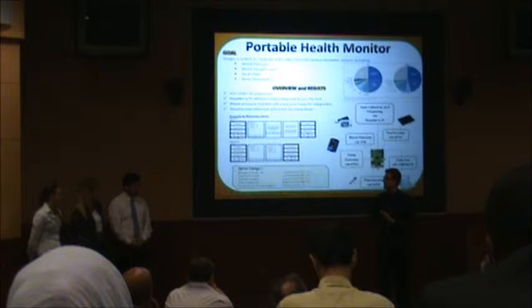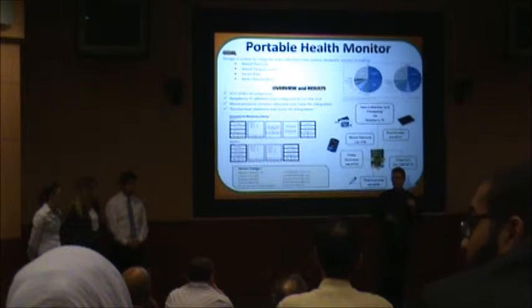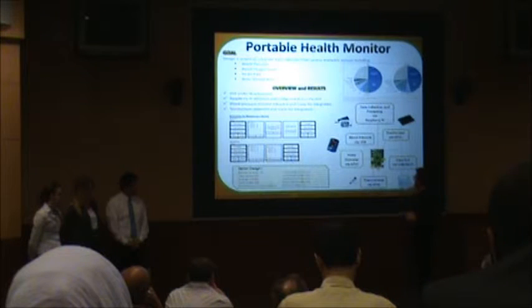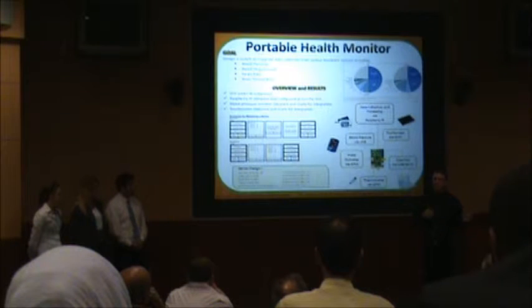So our aim is to create a device that will take blood pressure measurements, pulse oxygen measurements, heart rate, and also body temperature measurements. So we're using a Raspberry Pi as the base platform, mainly because of its customizability. We're developing an easy-to-use graphical user interface so that the patient can interact with the system and take measurements easily.